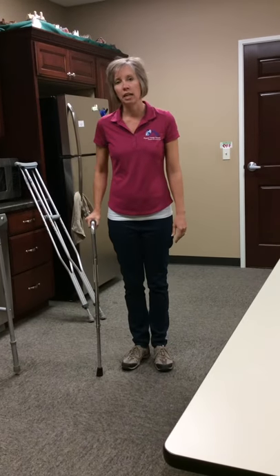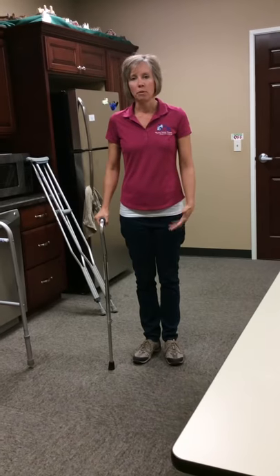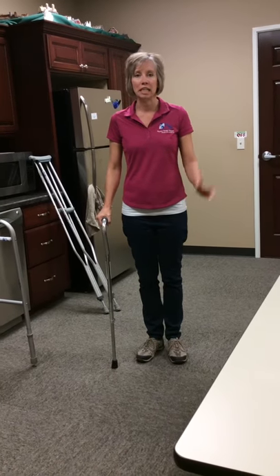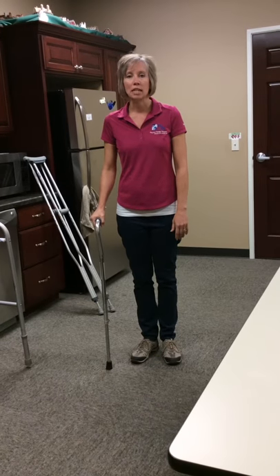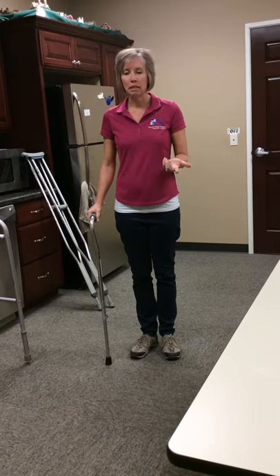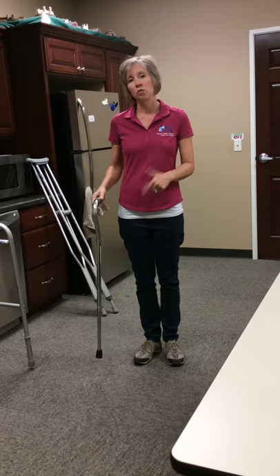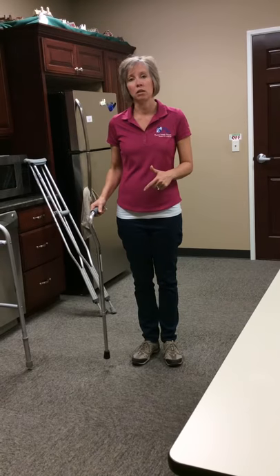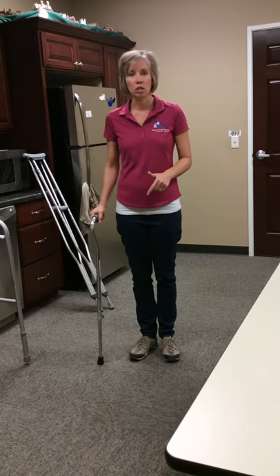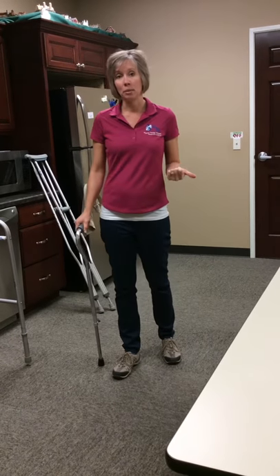The cane is used to help a little bit with balance. Most commonly we see it with the elderly population, but here we use them a lot with our knee patients after they've had knee replacement surgery. Probably the biggest assumption people make is that you're going to use it on the same side as the weak side or the surgery side, but in actuality you want to put it on the opposite side.